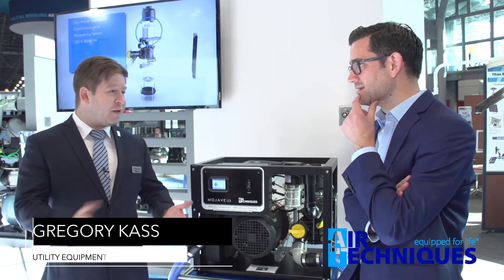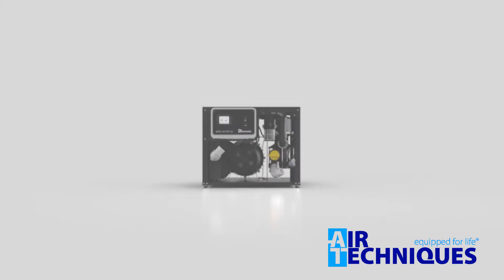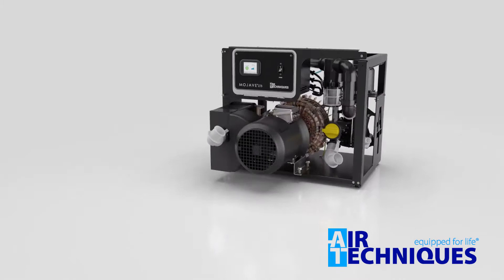The vacuum is the heart of the dental practice — without it, the doctor can't really see patients, work on patients at all, or do any kind of surgery. So making sure that your vacuum is up and running is critical for any doctor. What we've created here is the new Mojave LT3 dry vacuum system. This is completely waterless.